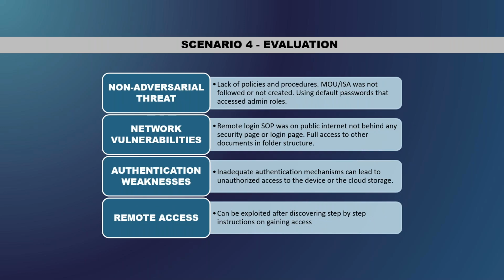This scenario 4 was an internet search of default passwords being used for medical devices, which resulted in a site that showed full procedures on how to remote into the device and the server residing on the healthcare system network. And this actually happened. But this was a classic example, I thought, going back, of a non-adversarial threat. The contractors, there wasn't an MOU or ISA in place. They didn't know, they were doing good by writing out the procedures on how to remote into the device so that they can review the cases and diagnose the cases.